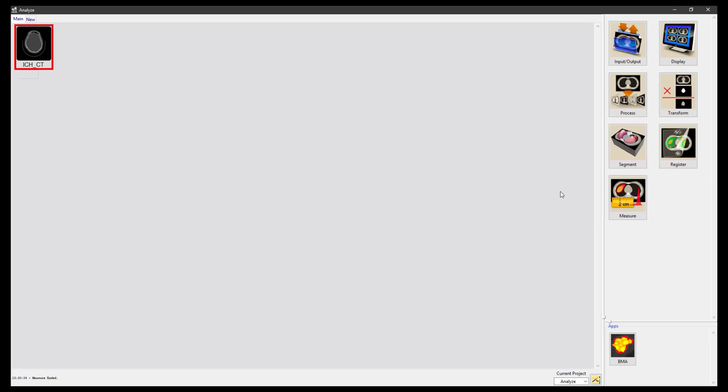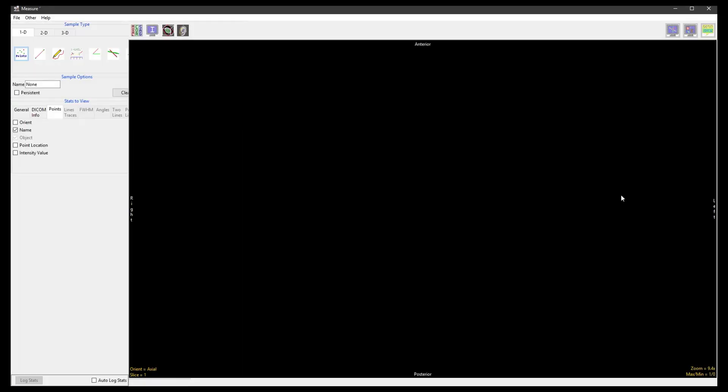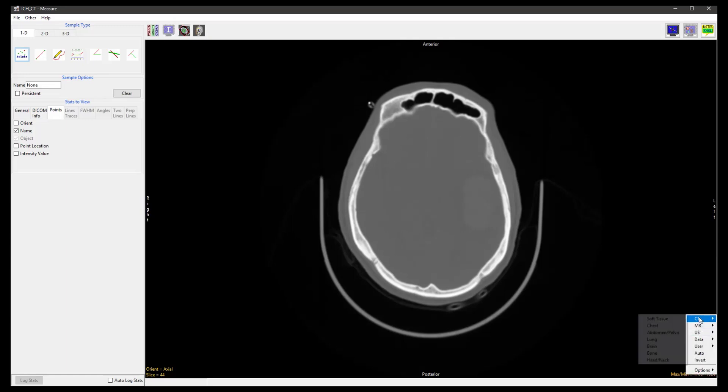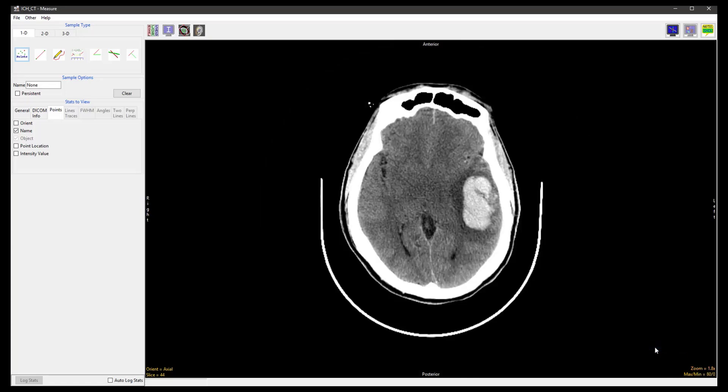To start, select the dataset and open Measure. With the axial view as primary, right-click on the Max Min option and select CT Brain. This will provide a better display of the brain structure in the CT data.